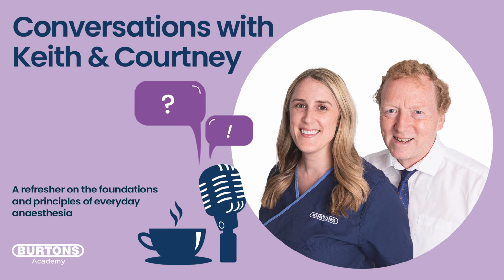Usually that starts with a rapid rise, and these are the things that we can start building on. It should be a rapid rise because we're breathing out quickly, with those alveoli emptying collectively and then starting to push on little bits of dead space towards the bronchioles, but eventually all that dead space fresh gas has been pushed forward, and we've got alveolar gas.